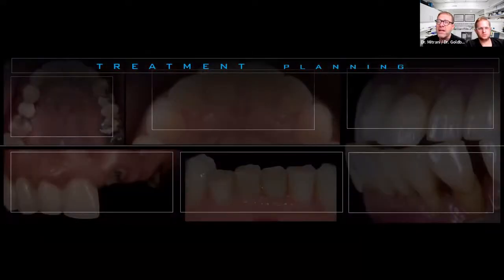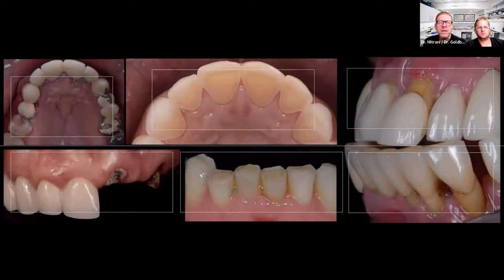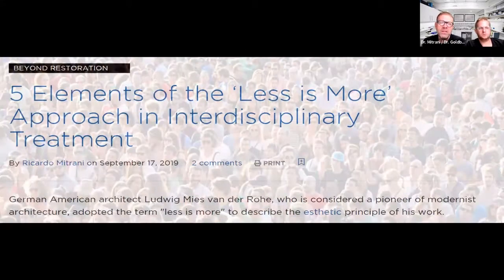Now, the reality is that a lot of what we do in dentistry is repeating old dentistry. And mainly when we go in and we try to help our patients redoing dentistry, a lot of that dentistry has been incredibly invasive to begin with. And so, we end up truly struggling, working with many patients that have very little tooth structure left, or that have very invasive restorations.